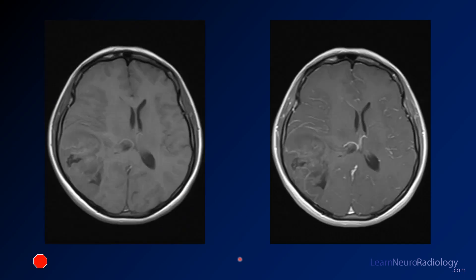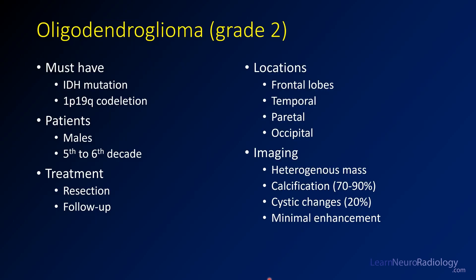On pre- and post-contrast imaging, these conjure up images of a low-grade tumor. You have an expansile mass, slightly hypointense to the rest of the gray matter. There are areas of low intensity corresponding to calcification. On post-contrast imaging, there is very minimal enhancement — maybe a little hazy enhancement centrally and a few associated vessels, but not much enhancement overall. This is a grade 2 oligodendroglioma.